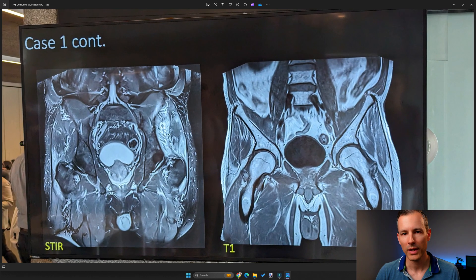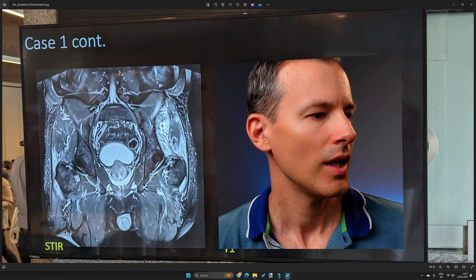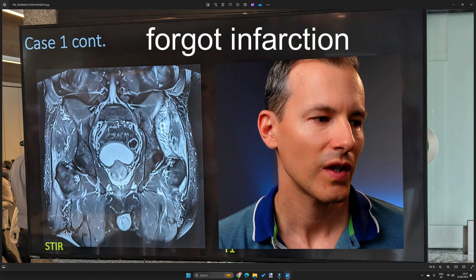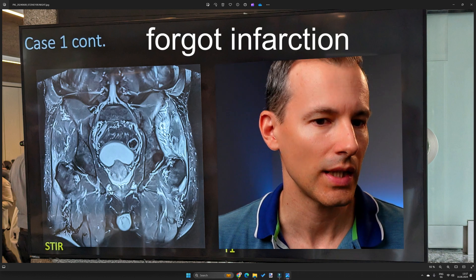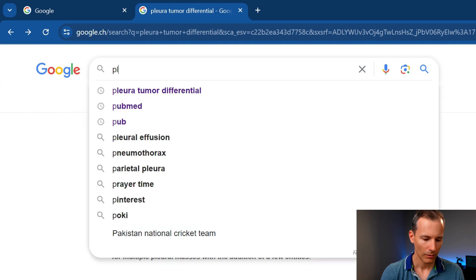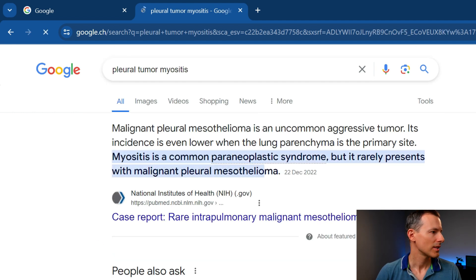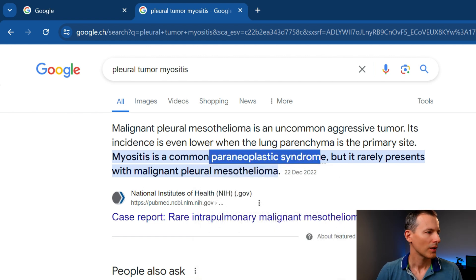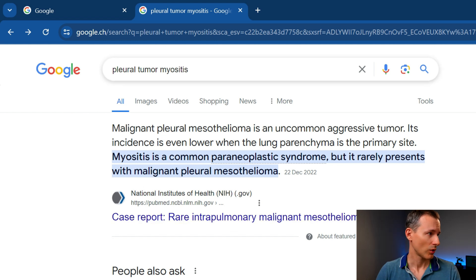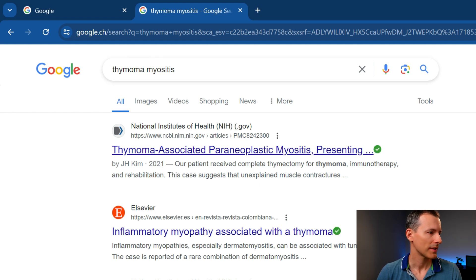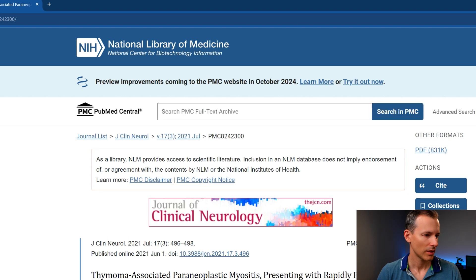Going back to the image: what can cause muscle edema? Differentials include muscle strain or injury, but there's nothing traumatic in the history. So it must be something inflammatory — when muscle is inflamed it's called myositis. I then Googled 'pleural tumor myositis' and very quickly came up with the idea of paraneoplastic syndrome. Because I wasn't going the malignant tumor route, I specifically searched 'thymoma and myositis.'